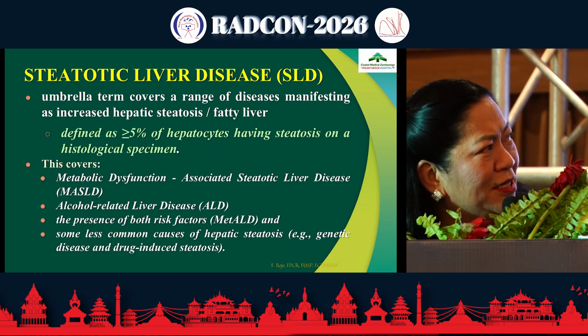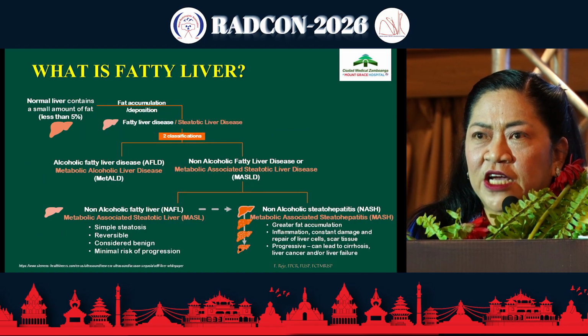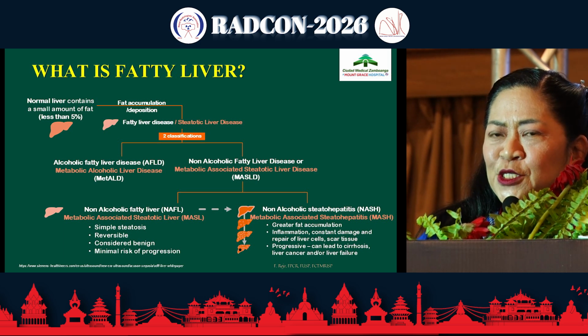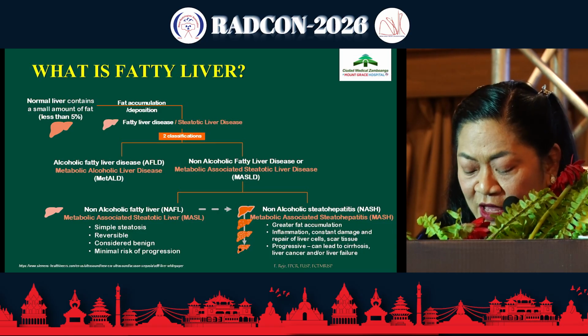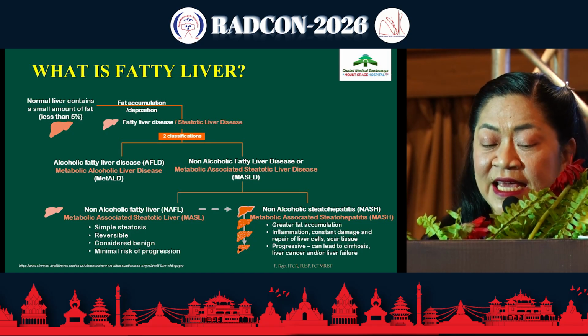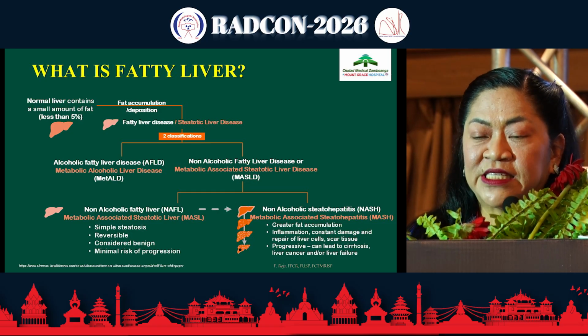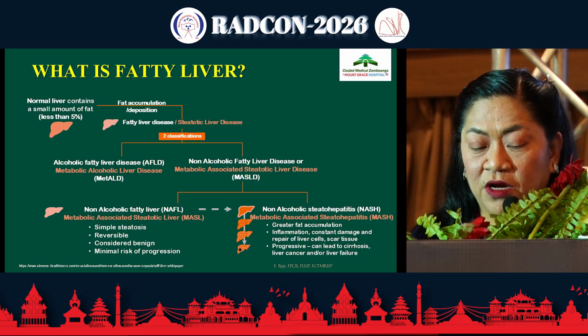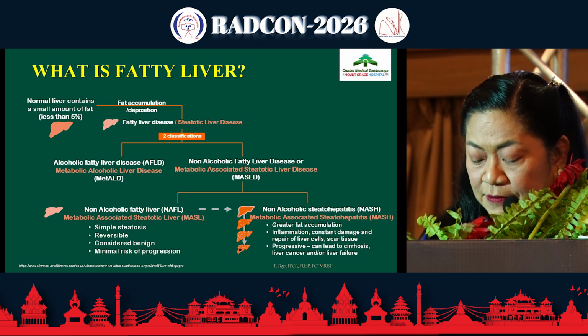So now I'm going to have a little time to talk about liver fat. I don't know if liver fat quantification is here now, but since we had the MindRay early yesterday, more likely that already has the liver fat quantification. We're just using the word now steatotic liver disease. And if we say steatotic liver disease, that means more than 5% of fat in the liver. Okay? It can cover metabolic dysfunction-associated steatotic liver disease, or MASLD, and alcoholic liver disease.